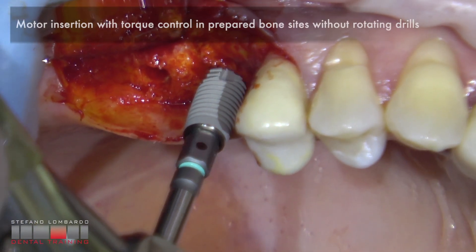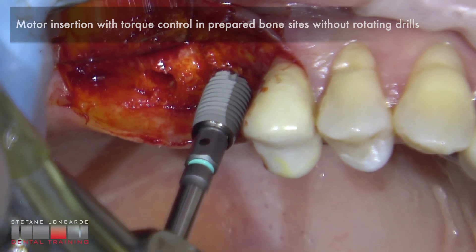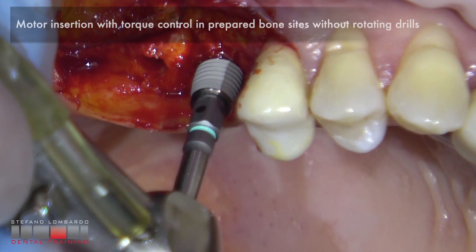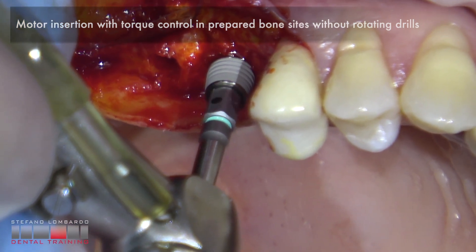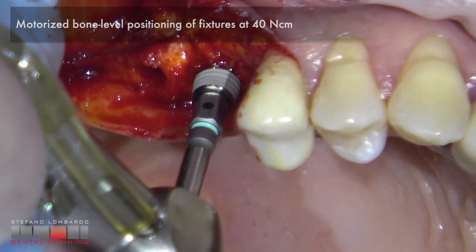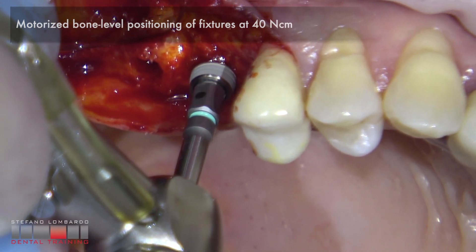Motor insertion with torque control in prepared bone size, without rotating drills. Motorized bone level positioning of fixtures at 40 Ncm.